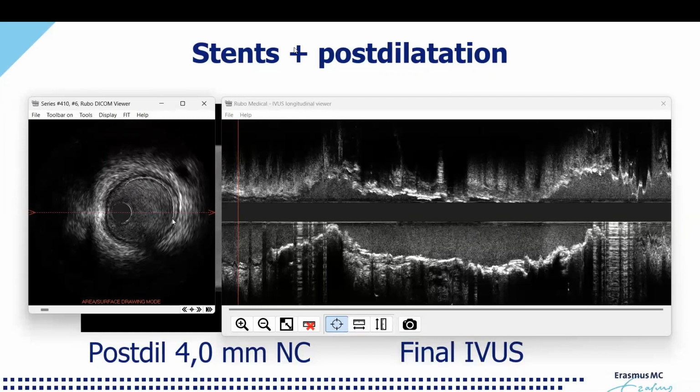Again, the OCT people will say, no, you need to use the EEM. Well, we can assure you, if you pick a frame in which the plaque burden is as small as possible, there is no difference between picking the EEM and then going 0.25 millimeter down, or picking the lumen and going 0.25 millimeter up. It's exactly the same. And in this case, you can appreciate that the diameter is 3.68 times 3.15, so that justified in this case a 3.5 stent that was chosen.